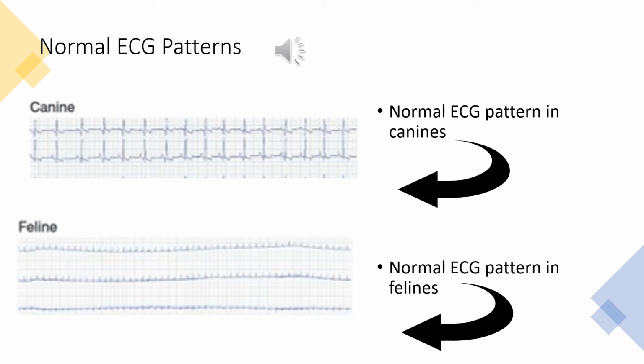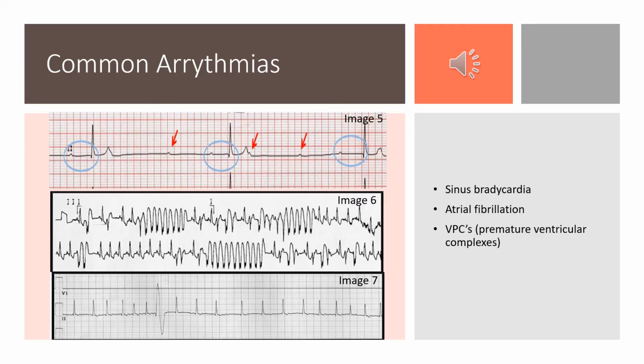In the next two slides, we will briefly look at a few of the arrhythmias that the ECG machine can detect, as well as a few of the artifacts that can occur. There are numerous arrhythmias. This is just a small grouping of a few of them. The first indicates the patient is in sinus bradycardia. This rhythm that originates in the sinus node is conducted normally, but has too slow of a rate.